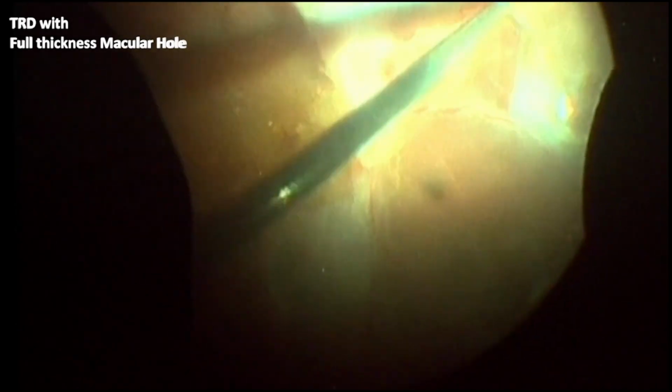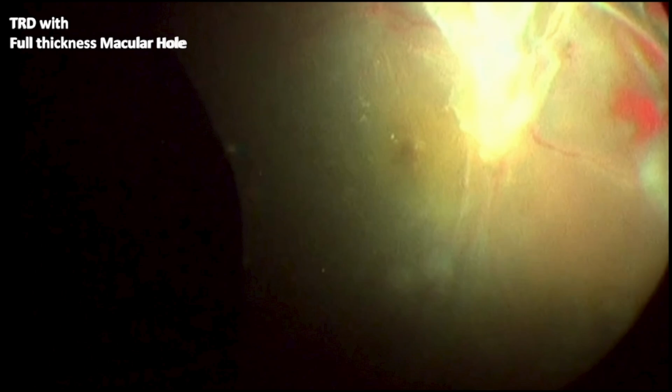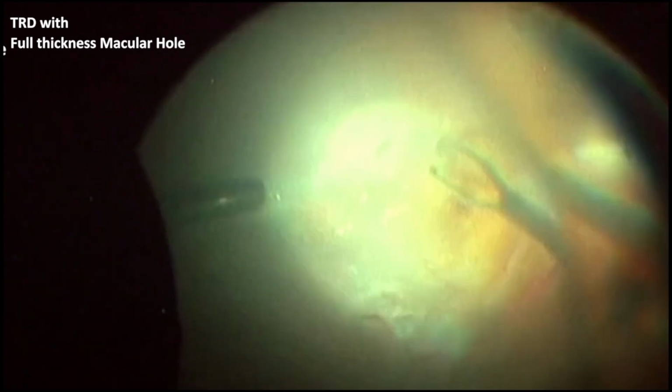A TRD with macular hole can have flat proliferations and firm adhesions. A careful segmentation and delamination, with care not to apply traction over the macula, can yield better surgical outcomes. An inverted ILM peel in such cases may be preferred for successful hole closure.